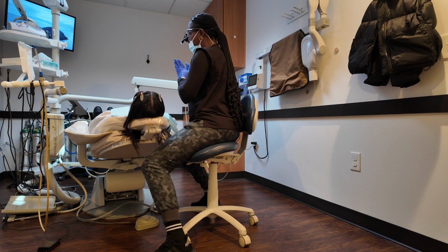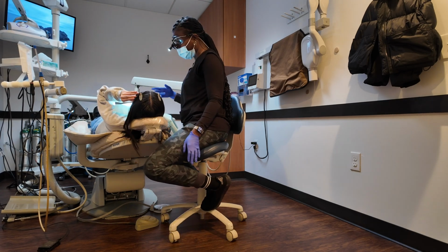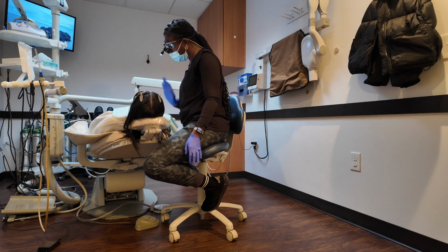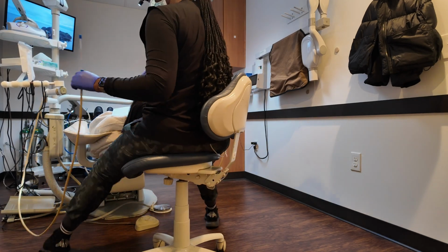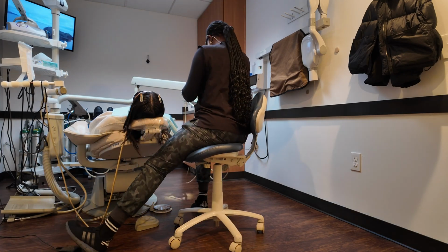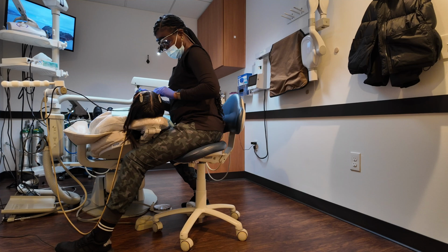Another thing that I always like to do is always ask my patients if they've changed anything that they've been using, especially if they come in and have irritation. So I'm always asking if they're using a manual brush or an electric brush, which kind of toothpaste, if they're flossing. We can always tell, by the way, if you're flossing or not. We just ask to see what you'll say to us.